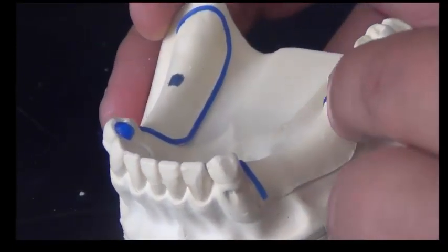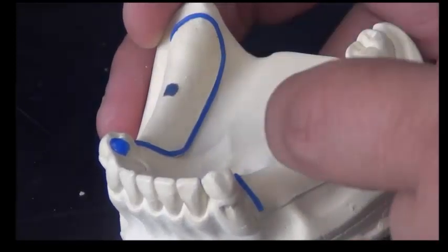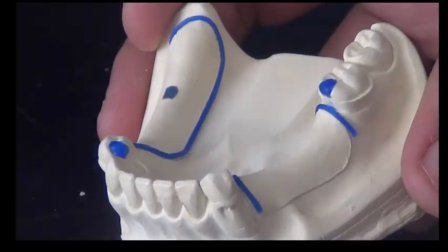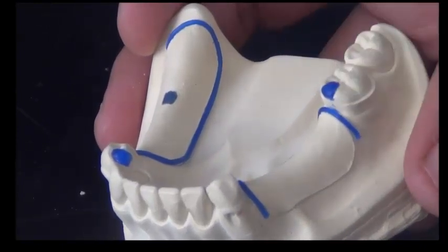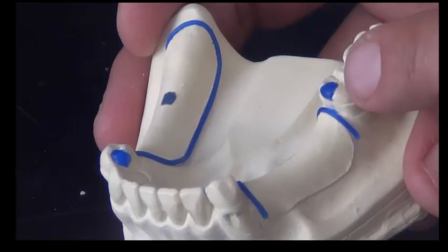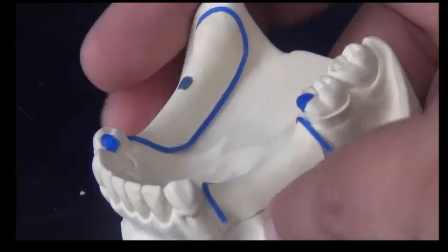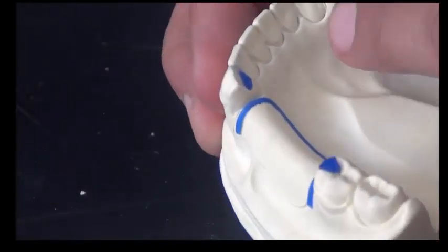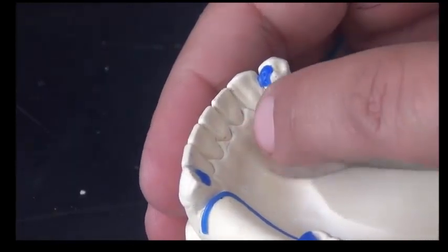And make sure that the rest area is thick enough with metal, because later on we will be finishing and polishing the metal, so we don't want it to be less. So we tried just to go back and make the marginal ridge continuous between the two cusps. Okay. For the premolar, which is a single rest, it's far away from the free end saddle. It's separated from the saddle.